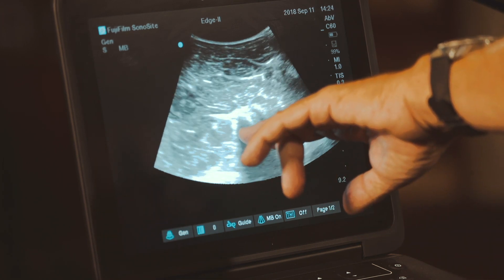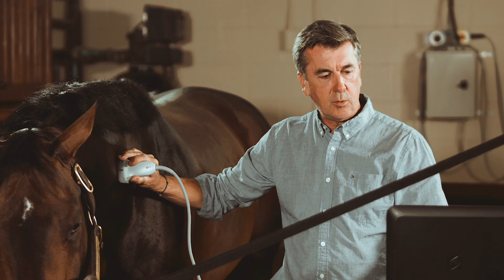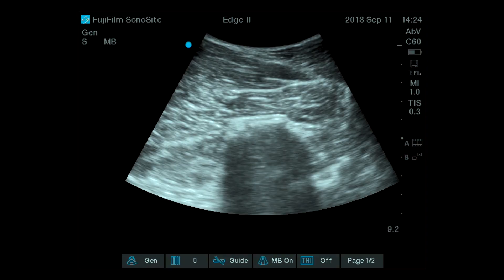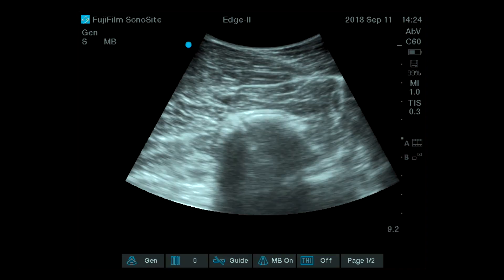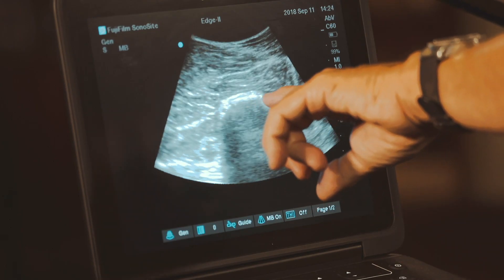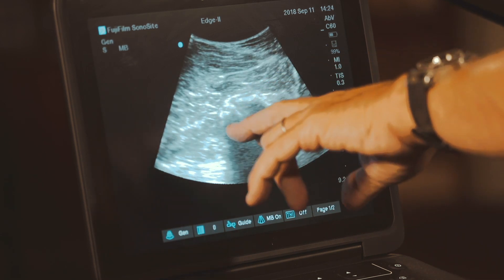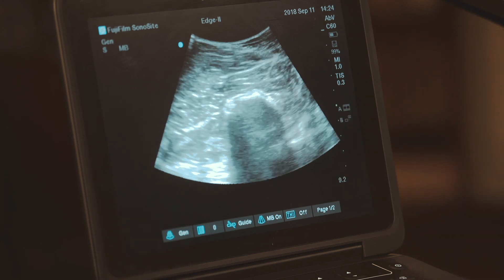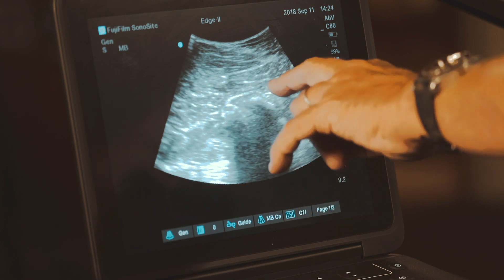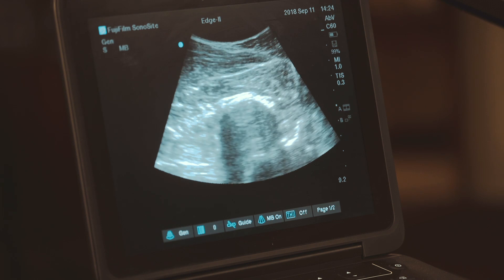Here you can see caudally and cranially of every facet joint you are evaluating. Now we get to C5-C6 where you can see the facet shape changes a little bit and it is much wider. If you look carefully at the edge, you see almost like a second line. That second line may be the capsule inserting on both sides of the facet opening — this is the joint space opening here, and on the margin you have this small line which represents the capsule.